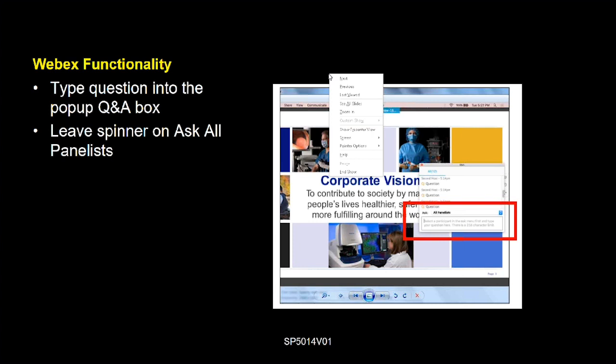How much time do you think that you have to allocate to examinations when adding NBI? Okay. Actually, I would like to add also that to see those patterns that we talked about today, I'd like to hope that after going through this webinar you'll jumpstart your ability to recognize patterns. But that takes a little bit more time to become adept at looking at it. The key is to still the images, look, and then I often write a little note to my pathologist, and I get some feedback as to what I thought it was and what they are, and that helps accelerate the process of learning.